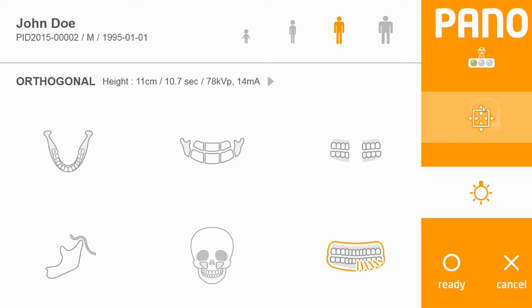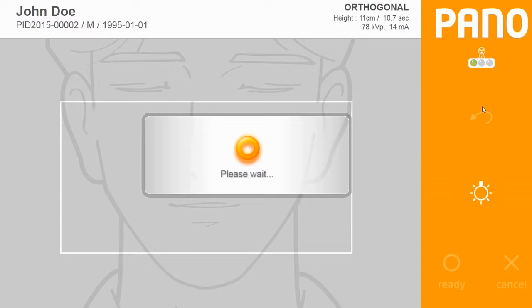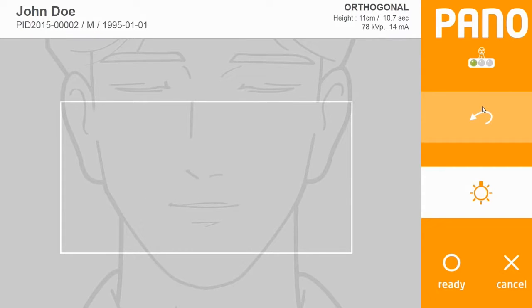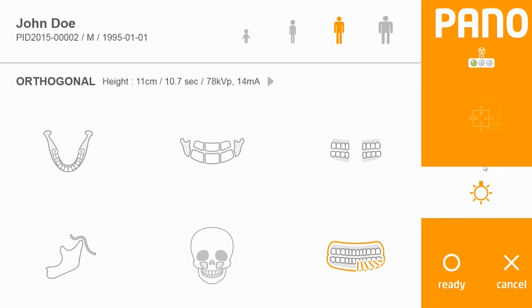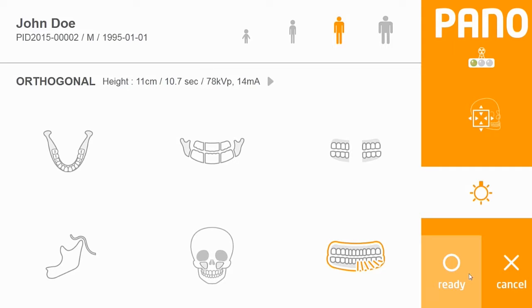In the orange section at the top, you can adjust the region of interest with the remote. You can also turn the positioning lasers on and off. The ready button puts the machine into a ready position, and you can cancel out of this window if you choose. Once you have a patient positioned using the positioning lasers and appropriate chin rest, click ready. The machine will move into the ready position. The LED above the X-ray generator will turn from blue to green, and once it is green, that indicates the system is ready. When the user presses the exposure switch, the LED will change to yellow and begin to acquire the image.